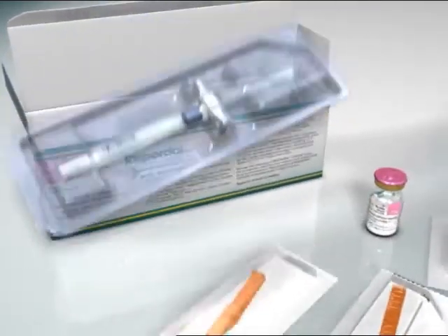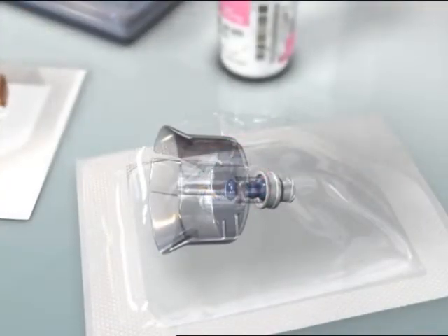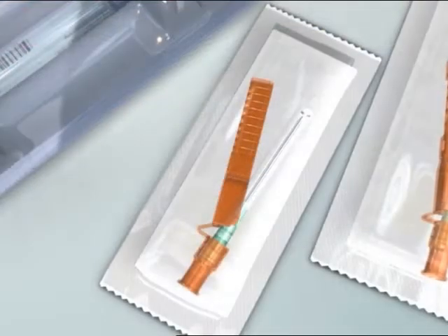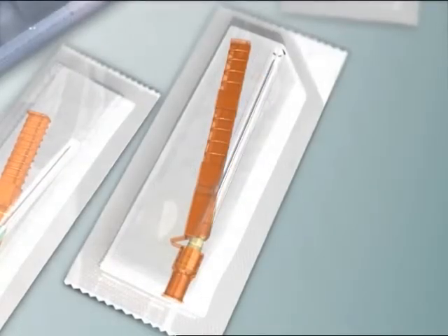There are five components: one vial of Risperdal Consta, one SmartSight needle-free vial access device, one syringe of diluent, one Needle Pro safety device for deltoid injection, and one Needle Pro safety device for gluteal injection.